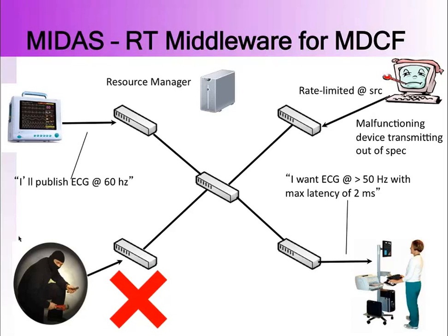No, for example, what's happening is we are in conversations with various middleware vendors like RTI that makes DDS, because the framework that we set up could be easily made to be compatible with the DDS interfacing standard. And so you would want to partner with an industry partner who would take on the full burden of doing the full certified development process.